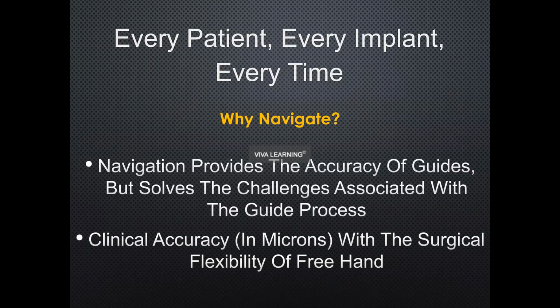So in my patient, you wonder, again, when we're talking why navigate, navigation is going to provide us the accuracy of guides, but it solves some challenges with guides.